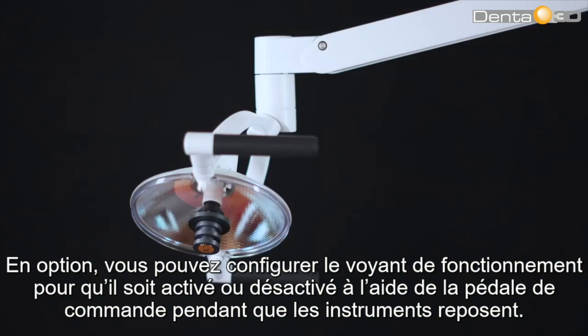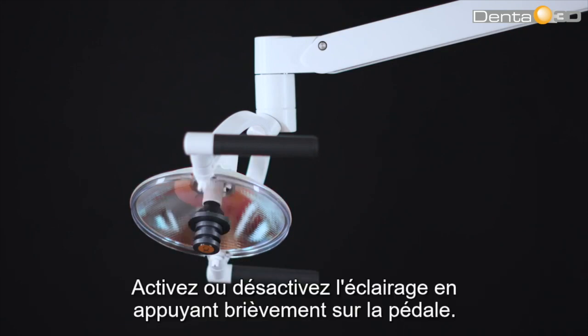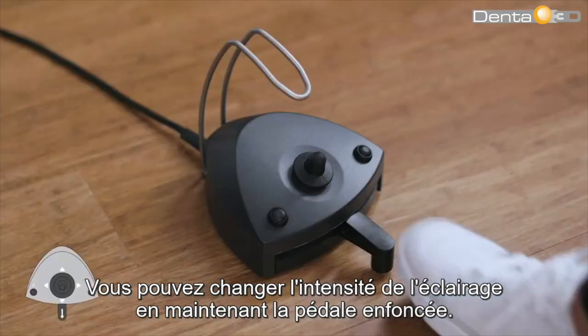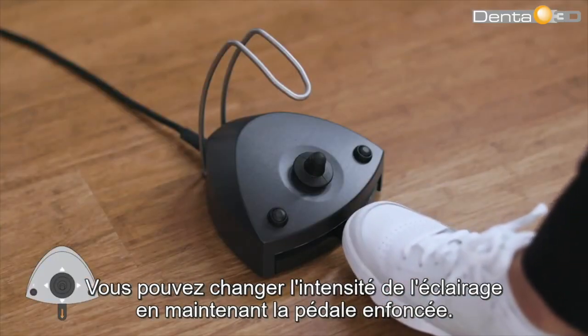Optionally, you may configure the operating light to be switched on and off using the foot control while the instruments rest. Switch the light on and off by pressing the pedal down shortly. Change light intensity by holding the pedal down.